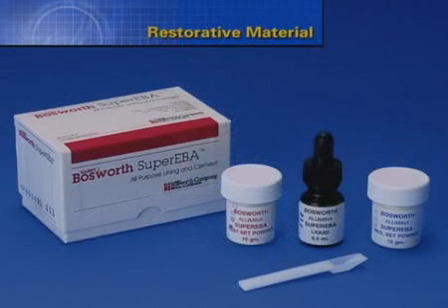When utilizing the resorbable barrier Collacote, the restorative material of choice is Super EBA. Super EBA resin cement is a well-documented, biocompatible restorative material utilized for repairing radicular perforations. However, after achieving crypt control, one drawback with Super EBA is that it's a little bit difficult to mix and sets rapidly.